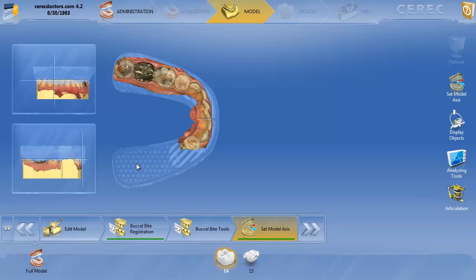This is actually going to set the occlusal plane. There are many different theories on what the occlusal plane should be — set by the lower, set by the upper, on aesthetics. Just so you know, the way that this average value articulator functions, it's actually going to be set by the lower arch. So we've established our buccal bite and our teeth contacts, and we now have our occlusal plane.